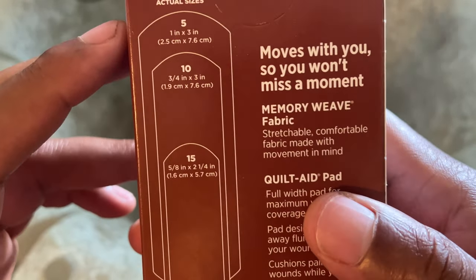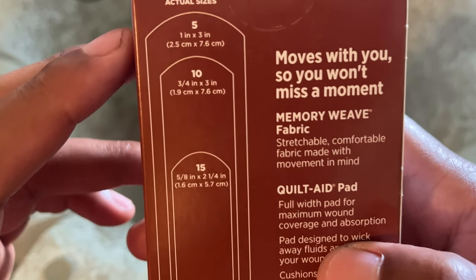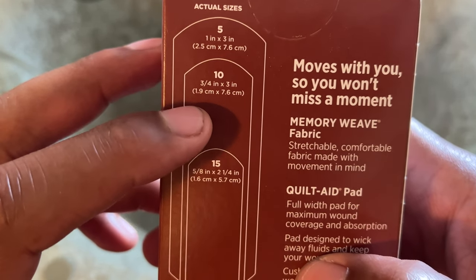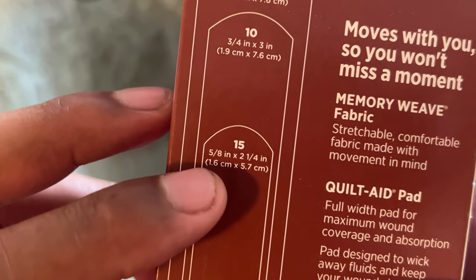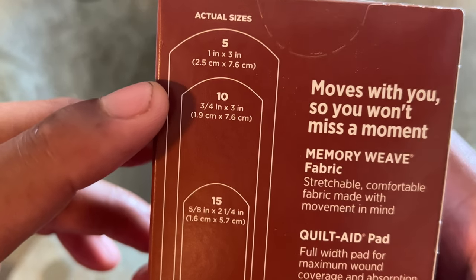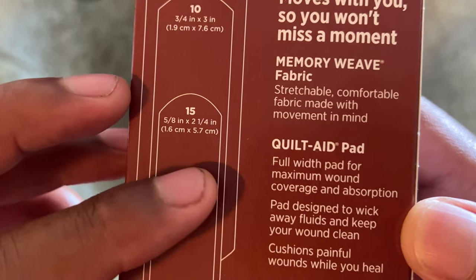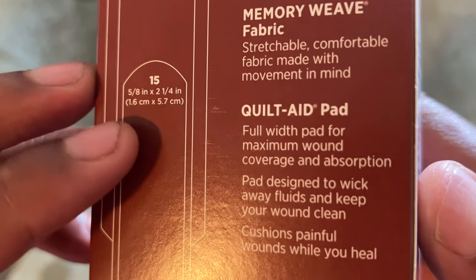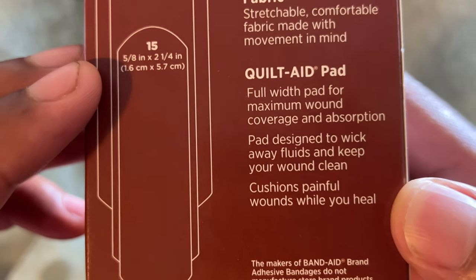Here they are. It says 'moves with you so you won't miss a moment.' It shows the different sizes in here — there's a 5, a 10, and a 15, with different measurements for each size. It also says 'quilt aid pad, full width pad for maximum wound coverage and absorption. Pad designed to wick away fluids and keep your wound clean.'